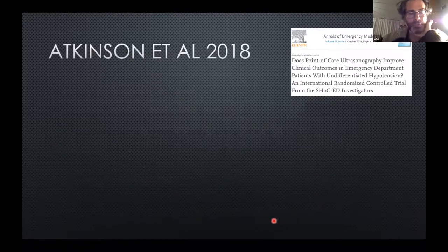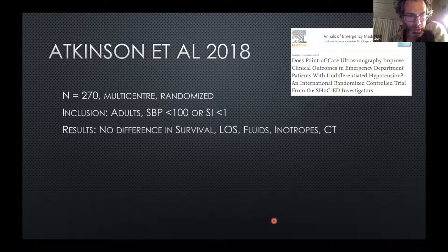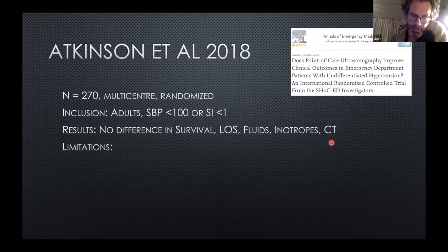Then there was a paper you may have heard about by Atkinson in 2018, which tried to show a mortality benefit to using ultrasound in shock. This was an even bigger, multi-center randomized trial looking at adults with undifferentiated shock. The finding was that there was no difference in survival, so it was a negative trial. There was no mortality benefit to patients who had an ultrasound for undifferentiated shock, and no difference in length of stay, fluids, inotropes, or use of CT. But there was quite a lot of talk about this and whether we should be using ultrasound in shock given there's no mortality benefit.